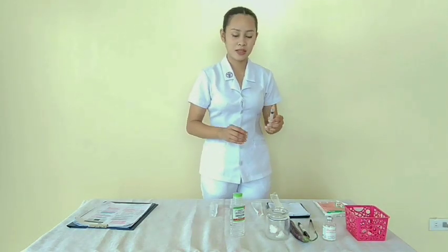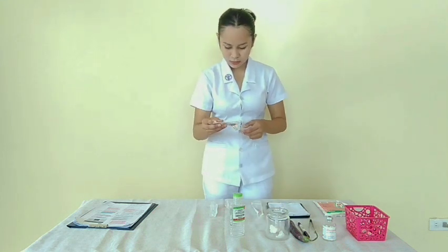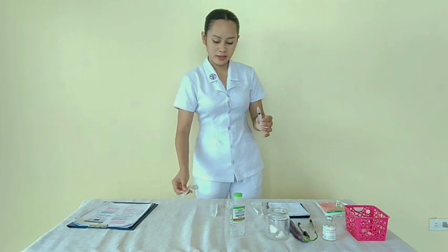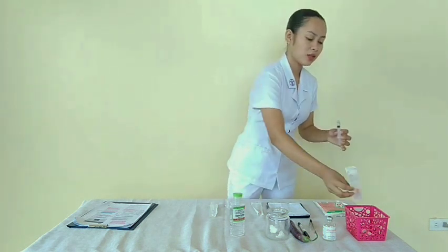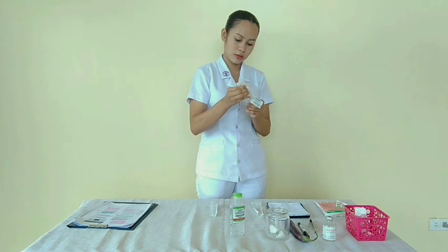Now I'm going to take the aspirating needle and discard it, and connect the barrel down to its appropriate size of needle and place it into the hypodermic tray. Then now I'm going to head over to my patient's room.